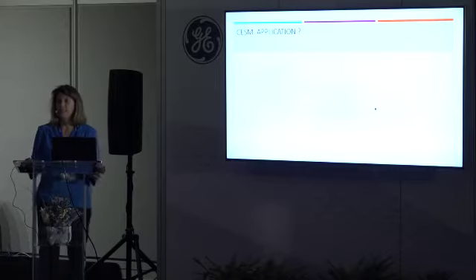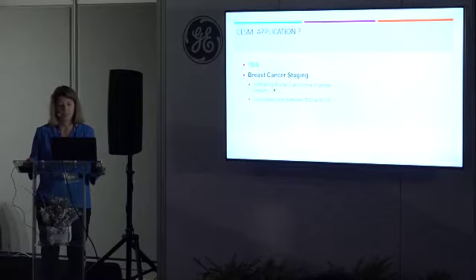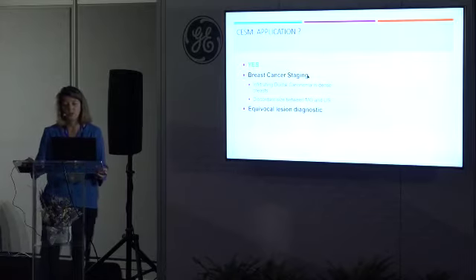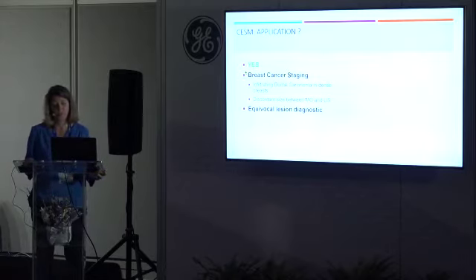So now, what are the indications today? In my hospital, we use it for two main indications. The first is breast cancer staging, especially when we have dense breasts, and it is very accurate to detect infiltrative ductal carcinoma or a discordant size of at least 1 centimeter between mammography and ultrasound. The second indication is non-conclusive mammography. It's quite common, and sometimes we have indications for MRI in these cases, and it's quite easy to perform contrast mammography on the same day instead of an MRI. So in my institution, we mainly practice these two indications for contrast mammography.